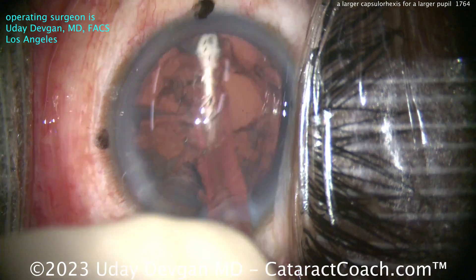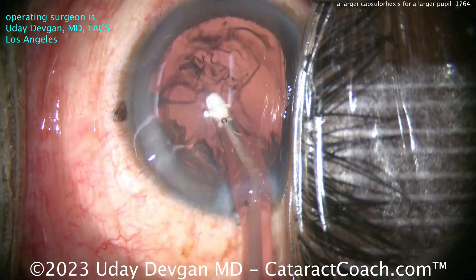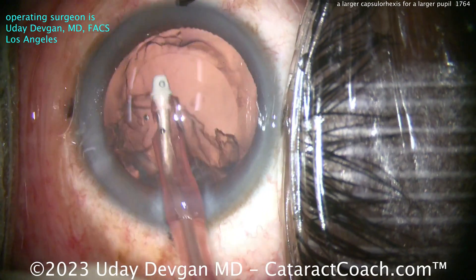So you're thinning up the cortex. Now as the cortex comes out of the eye, you'll be able to see that rhexis a little bit better. Otherwise it's just a routine case. Looks like he's also getting a toric lens. So cleaning up the cortex here, and then the rhexis will slowly come into view.